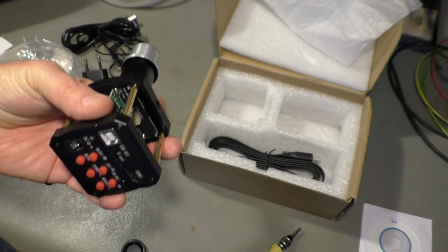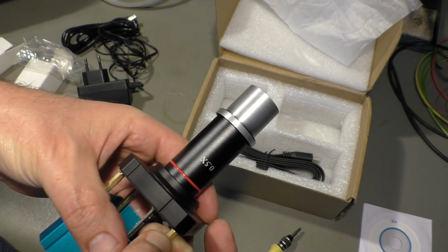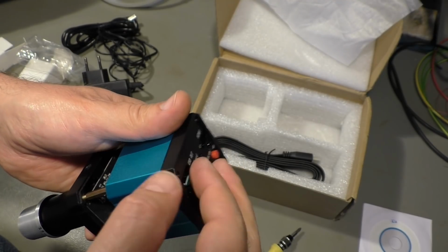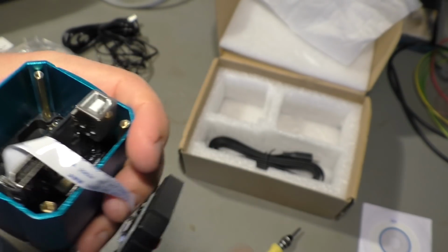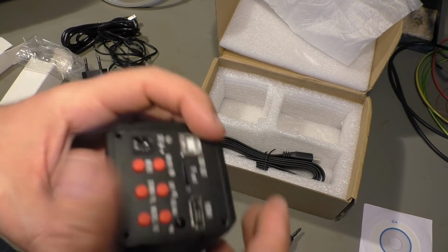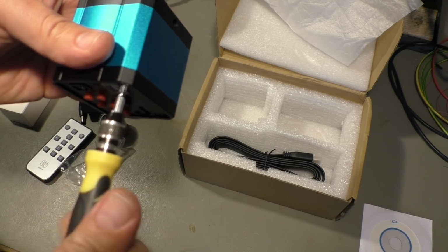Okay, so that's the inside. Not extremely interesting. Okay, I think I have to tighten these posts here a little bit. So two posts are going in, the others are sticking out, but I think that doesn't matter. Okay, let's screw it together. Okay, now it's in.